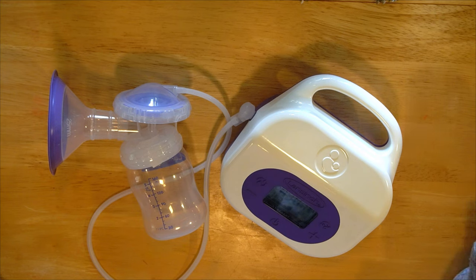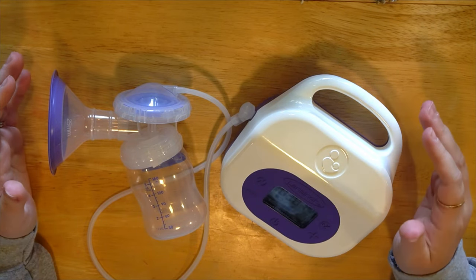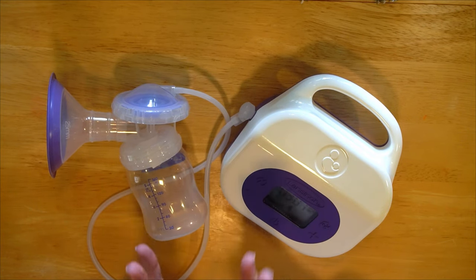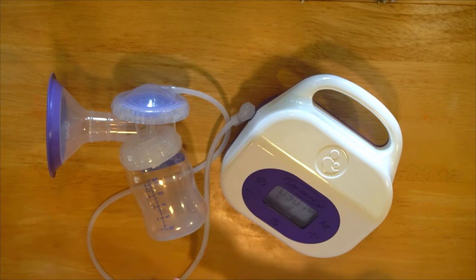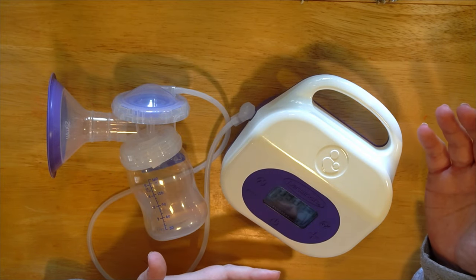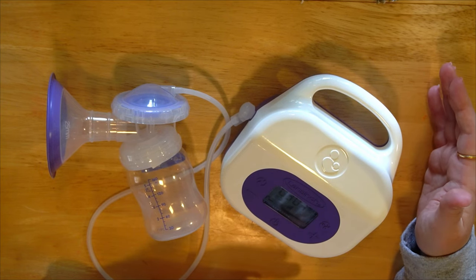All of our breasts are different. Hands-on pumping can almost double your output — it's scientifically proven through studies. It just means to massage your breasts and move the tissue around as you're pumping. A hands-free bra makes that far easier. Being relaxed and in a quiet setting also increases milk flow — those things are hard to find as a parent, but anything that relaxes you helps as well.